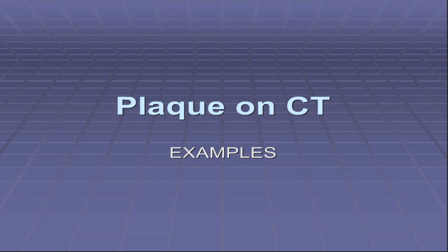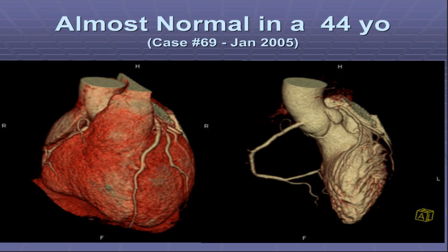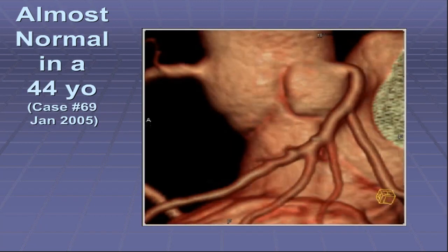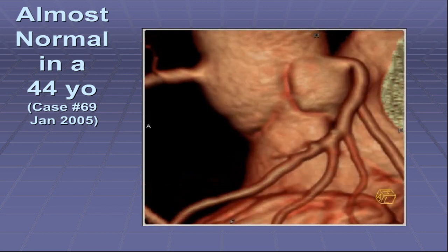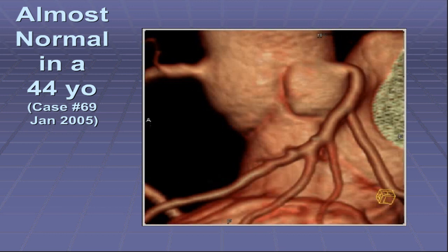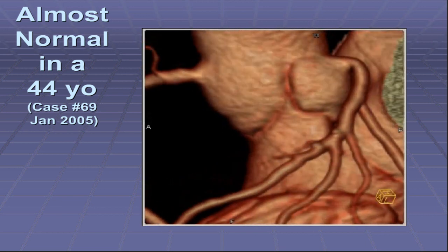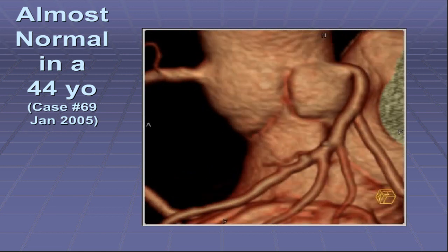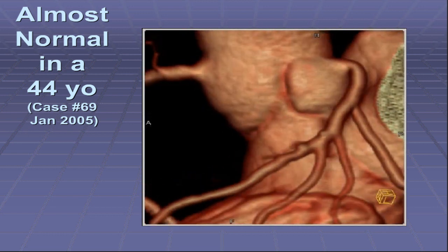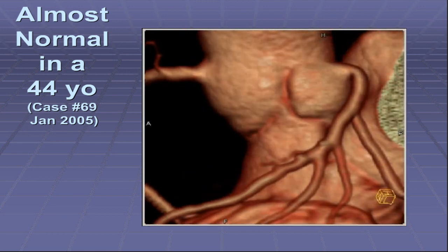So now, what does plaque look like on CT? Here are some examples. This is a 3D rendering of the heart — we've cut out the right ventricle and everything we don't want to see. When you zoom in and get a little closer, you start seeing little bumps on the vessel. All these little bumps are positive vessel remodeling — they are early plaque development. One, two, three little bumps on the LAD. This is what you're looking for. They're often very easily visible and easy to see.